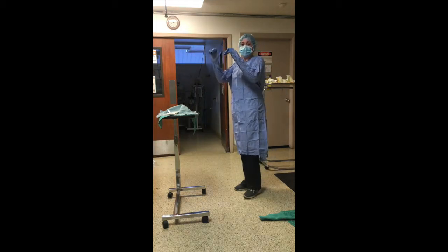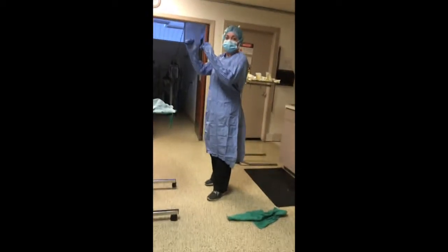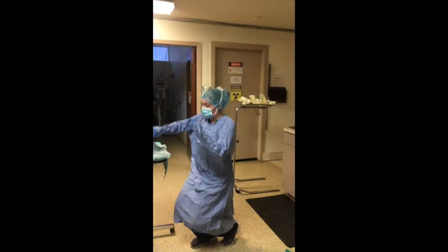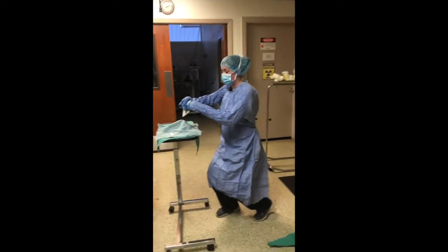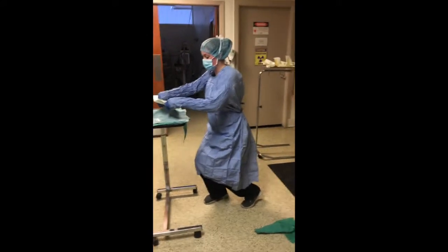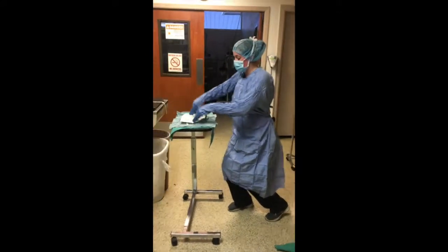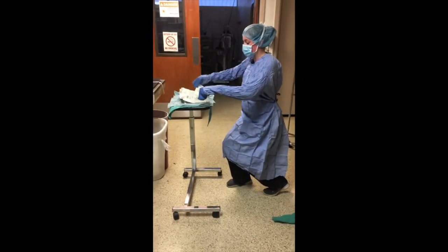Now that my assistant has tied me in, I'm good to go ahead and put on my gloves. Grab my gloves, open them up. So I'm going to be using the closed technique, putting on gloves.